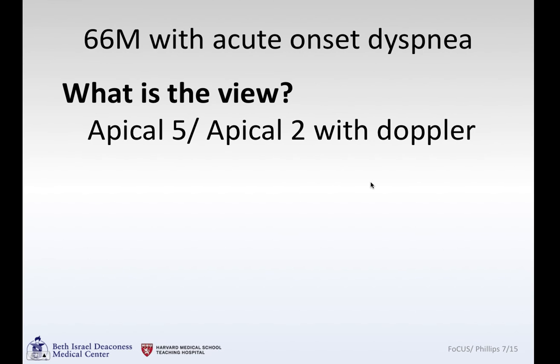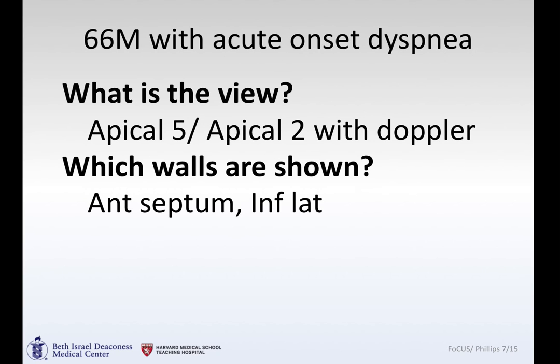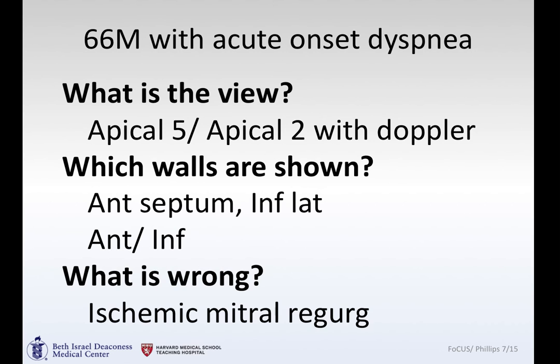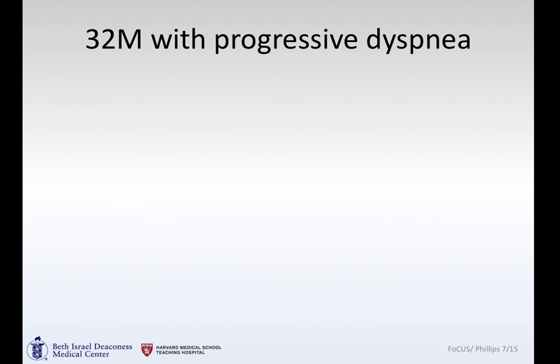The view is apical five and apical two-chamber with color Doppler. Walls shown: anterior septum and inferior lateral in the apical five; anterior and inferior in the apical two. Given the hint of wall motion abnormalities in the inferior wall and tethering of the mitral valve, this turned out to be ischemic mitral regurgitation.